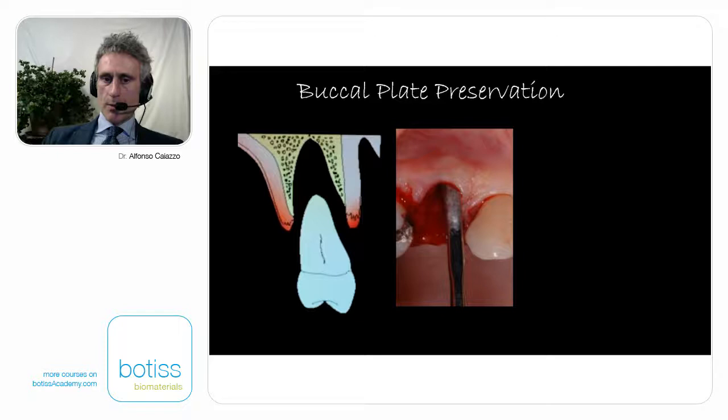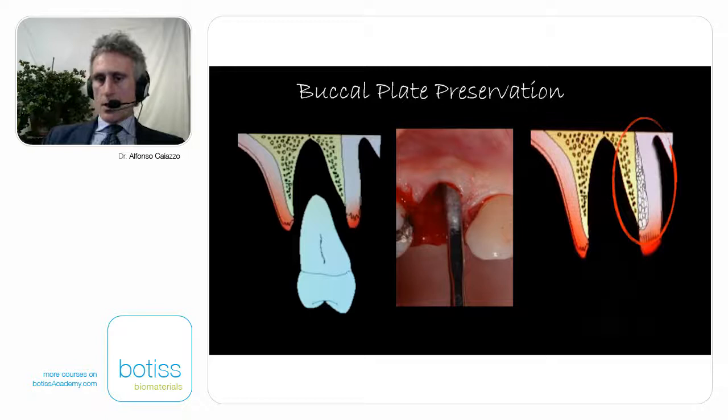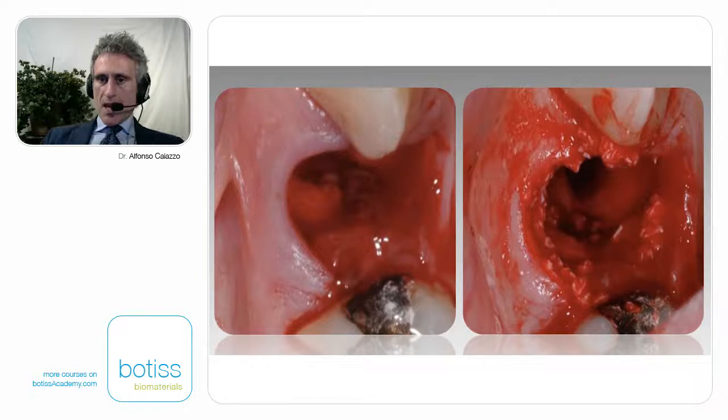You know, with this friend of mine from Rome, we chat all the time, we discuss cases, and we do research together. And one morning we said, hey, probably this could work. This is an idea. Let's start. And we started doing cases and cases and cases. And this is what we were seeing. Basically, we were mimicking the root eminence appearance just by placing a small amount of xenograft outside the socket, not interfering with the healing of the socket.